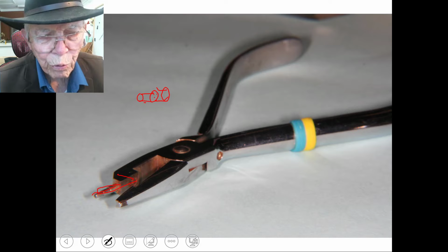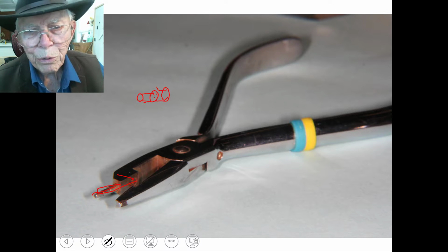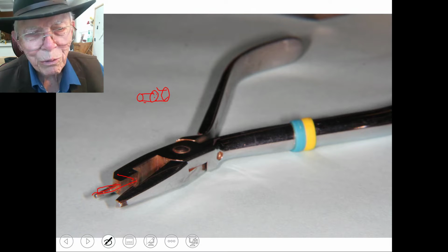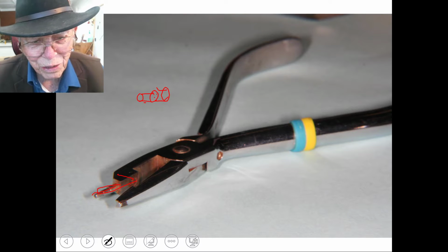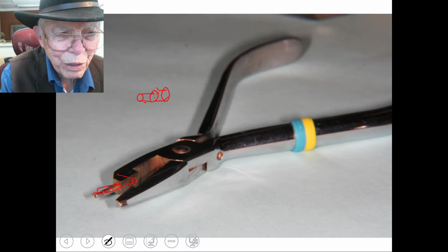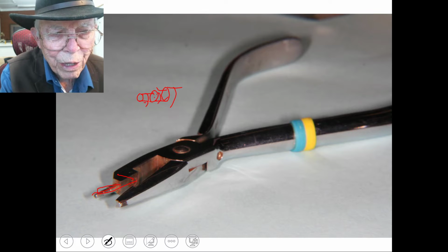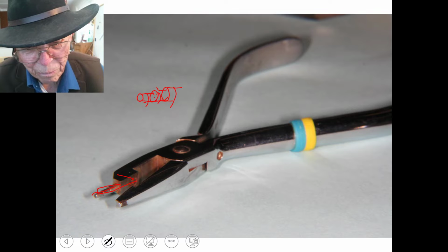I've never broken one, but they send an extra one with each pair of pliers when you buy them, and you pay enough for them. You know, they ought to send you something extra anyway. So that's the thing that we bend the loops around. I usually use this second one rather than the third or the first one right here, and they're level on the bottom side of these pliers right there.